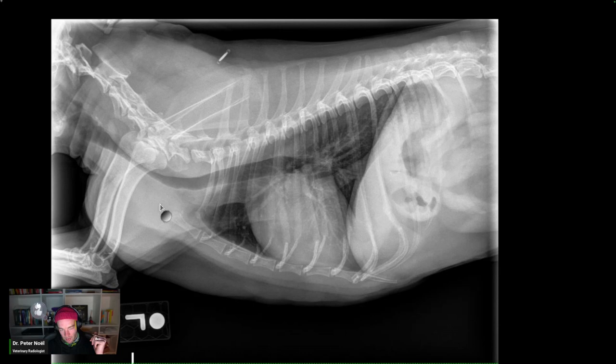The other thing that you can just throw out there in the exam room to look like you know what's going on is tracheitis, inhaled irritants, infectious tracheobronchitis. But I feel like that's more uniform. It's not this sort of focal dorsal, ventrally convex opacity. Sometimes we see redundant tracheal membrane. What does that mean? So that tends to be the term.